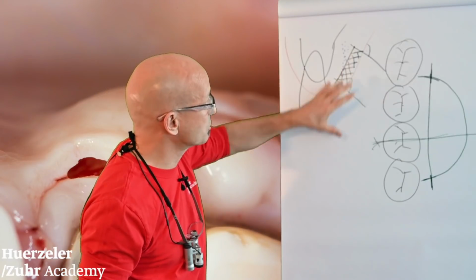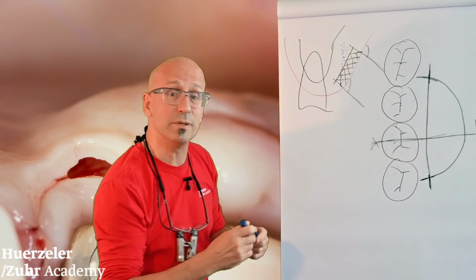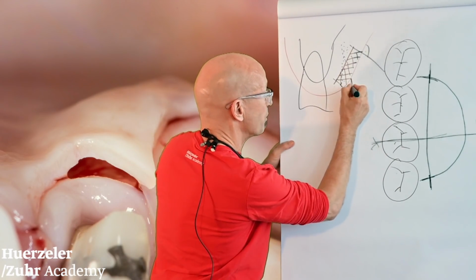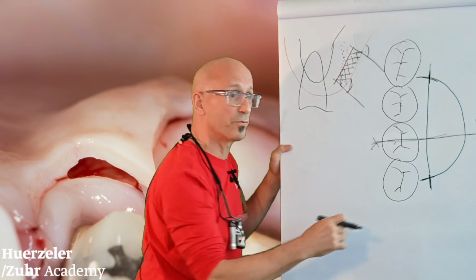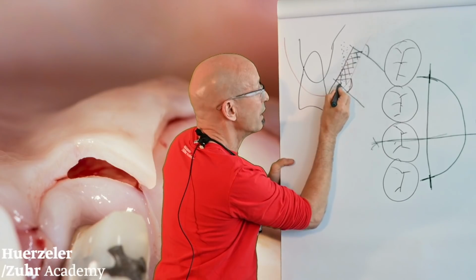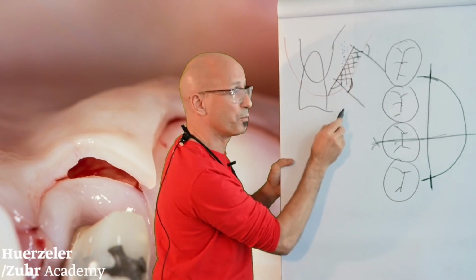Again, it's the same story here. It will be a little bit easier today when we do this now than afterwards on the apple. Here we go perpendicular. This everybody understand. To go perpendicular on the surface. And then we have to do a perpendicular incision to our first perpendicular incision.